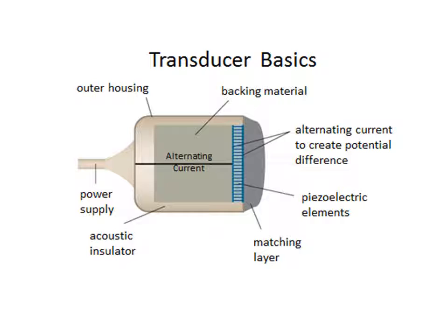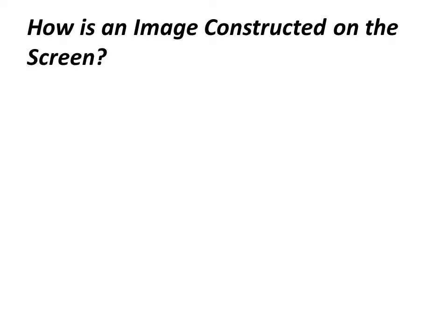The transducer acts as an emitter of the sound waves, and also the receiver. Most of the time is actually spent trying to receive the ultrasound waves back, and only a fraction of time is spent emitting the sound waves. So this is very important, the piezoelectric crystals in the transducer.